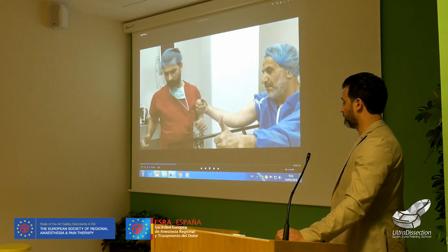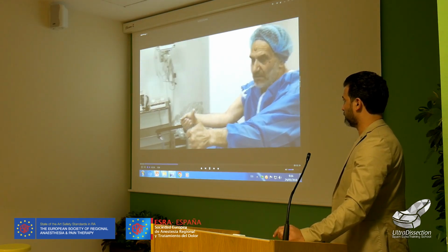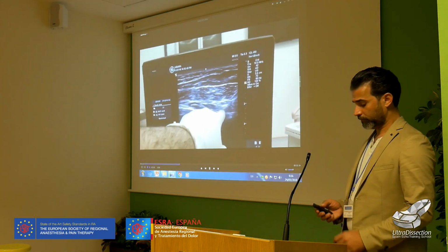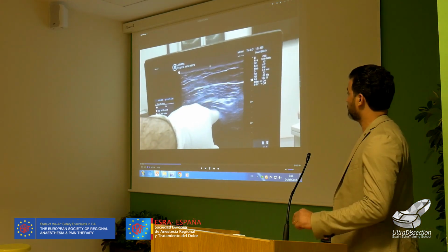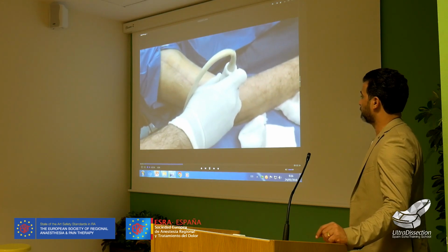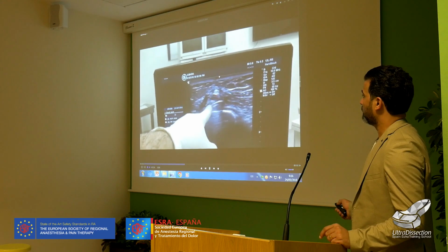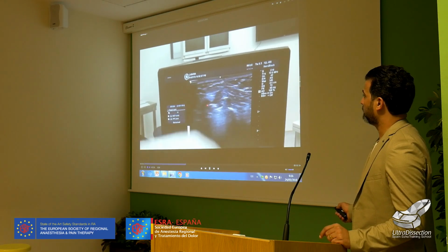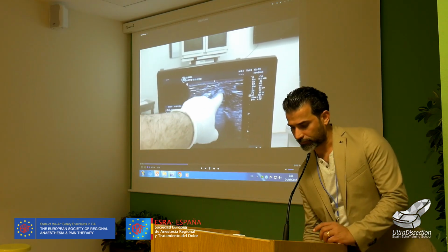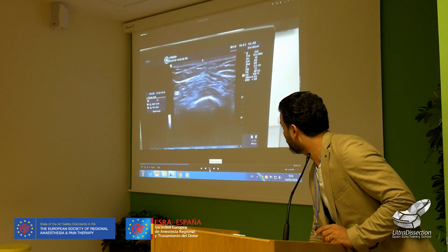Here this is somehow absent because of the radial nerve injury. So here this is the radial nerve after leaving the spiral groove. Now I will scan proximal to see. Here, this is the radial nerve, here the radial nerve, and here, see the fibrous tissue around it. The fascicles are hypertrophied.